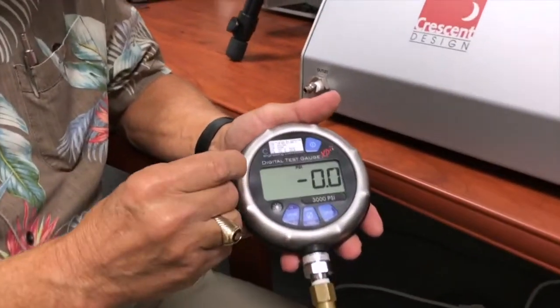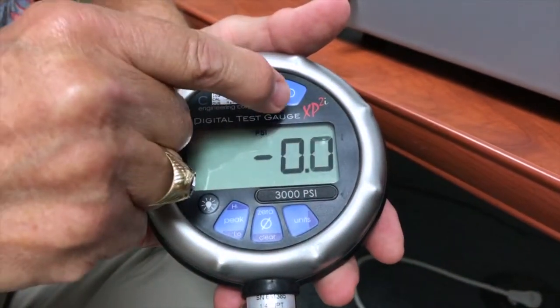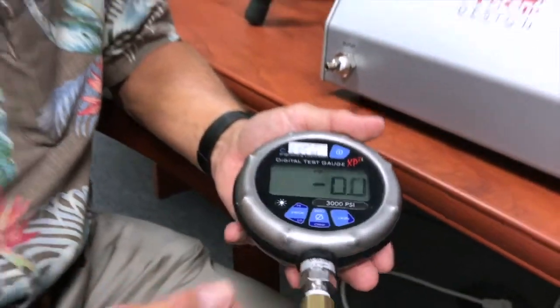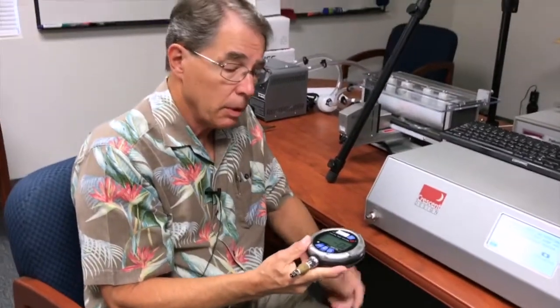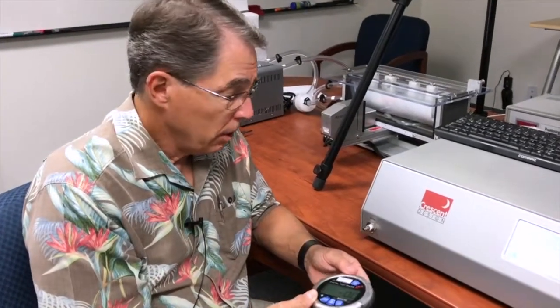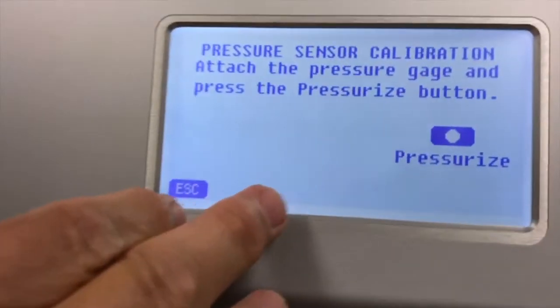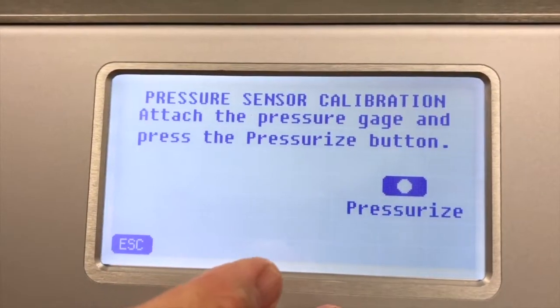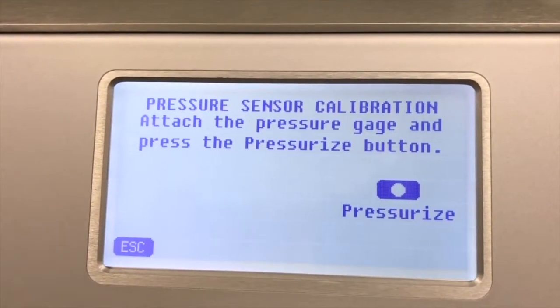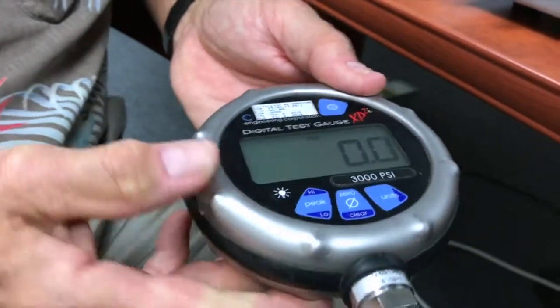The gauge is from a company called Crystal Engineering — it's an XP2I — and it is more than four times more accurate than the HBLT, which is required for proper NIST calibration traceability. The screen is telling us that we already opened the port and hit OK and it's now ready for pressurization. I'm going to zero the gauge just to make sure that it's zeroed and we're ready to go.